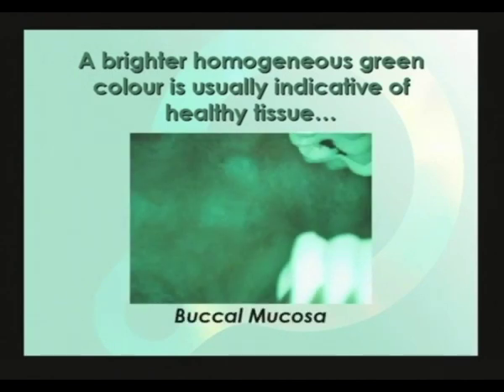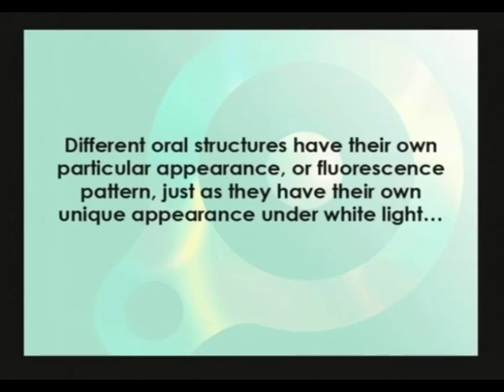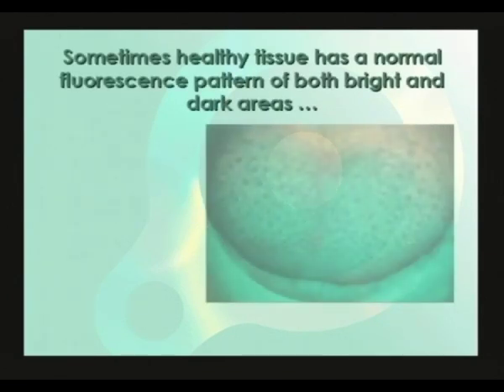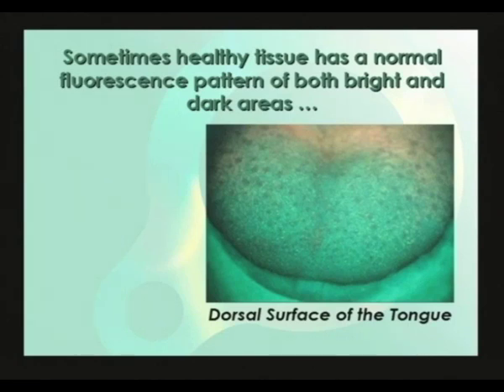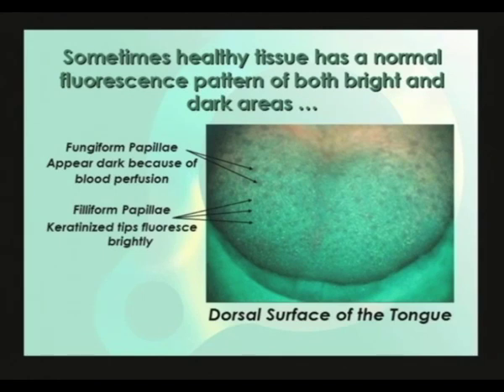Here we see the buccal mucosa with the highly fluorescing teeth on the right of the picture. With fluorescence visualization, different oral structures have their own particular appearance or fluorescence pattern, just as they have their own unique appearance under white light. Here we see healthy tissue that is a generally homogenous pattern of bright and dark areas. The dark spots are the fungiform papilla that appear dark because of blood perfusion, and the smaller bright spots are the filiform papilla, which have keratinized tips that fluoresce brightly under Velscope. Blood is a strong absorber and causes the perceived fluorescence to decrease, and keratin fluoresces strongly, which causes the perceived fluorescence to increase.